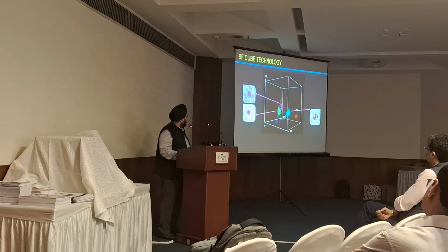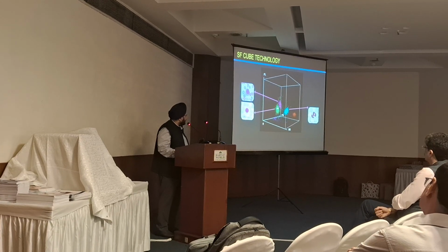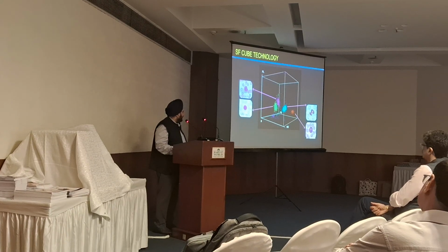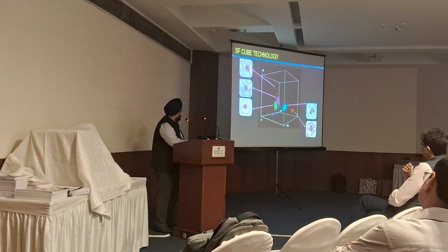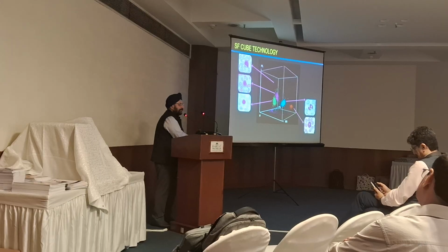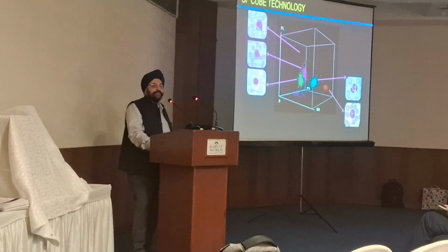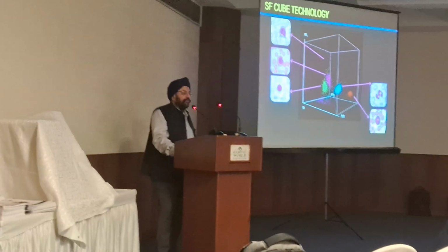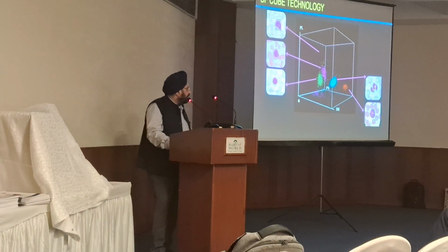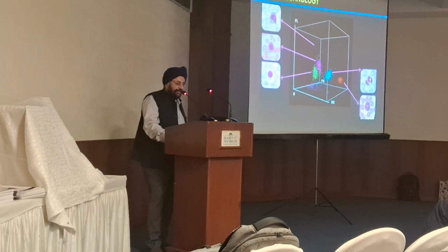This area in the middle is the area of the neutrophil and basophil, which have more granularity than the previous cell lines. And this area on the right extreme is the eosinophil, which has the maximum granularity. These small tiny green dots above the monocytes are the HFCs, or on some analyzers they are also called HFLCs, high fluorescence cells or high fluorescence lymphocytic cells. These are nothing but your old fashioned Downey cells, viral cells, transformed lymphocytes, call them as you may. These are primarily increased in most viral infections, and also increased in certain lymphoid malignancies.